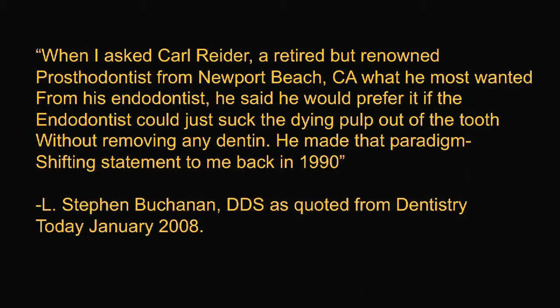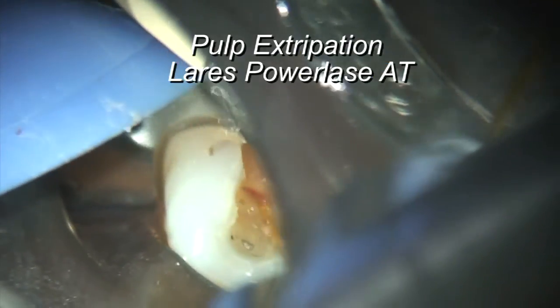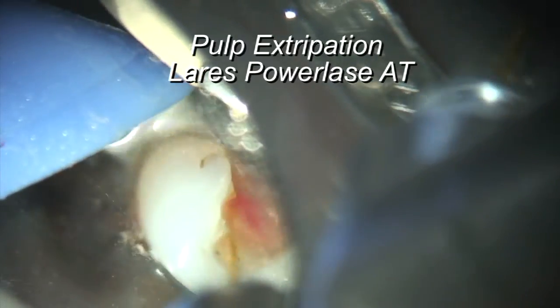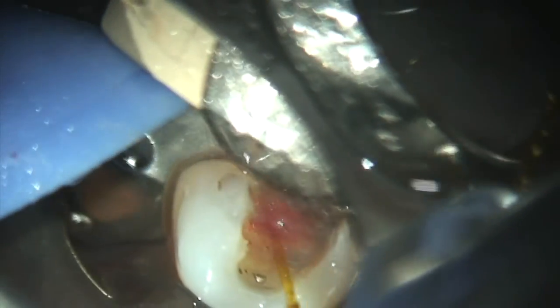This was in 2008. Steve Buchanan quoted this — when he asked Carl Reider, a retired but renowned prosthodontist from Newport Beach, what he most wanted from his endodontist, Reider said he would prefer it if the endodontist could just suck the dying pulp out of the tooth without removing any dentin. He made that paradigm-shifting statement back in 1990. Using PIPS, you can see the pulp just kind of pops right out.